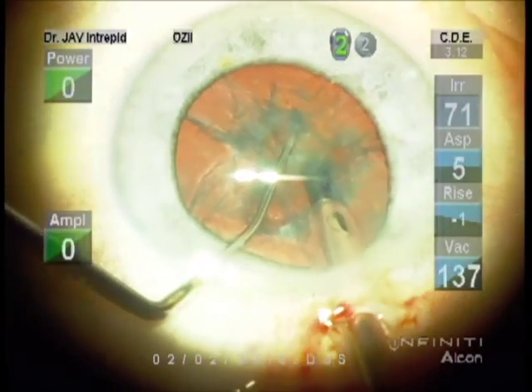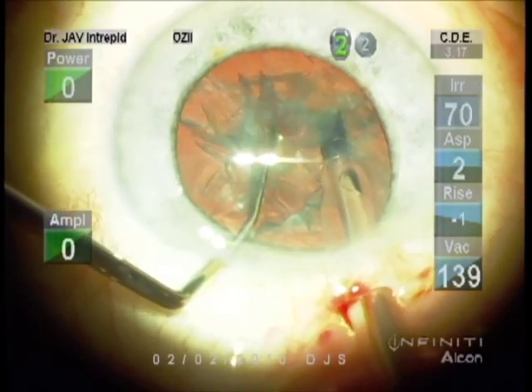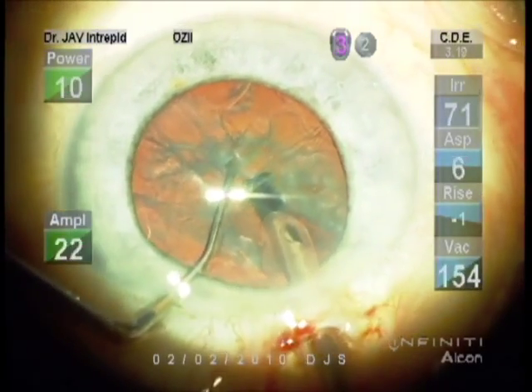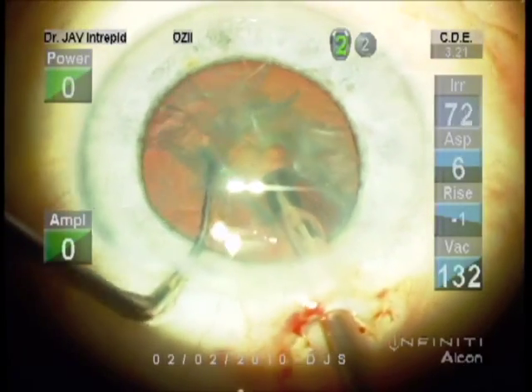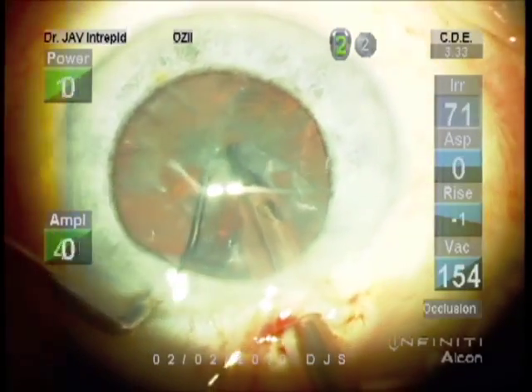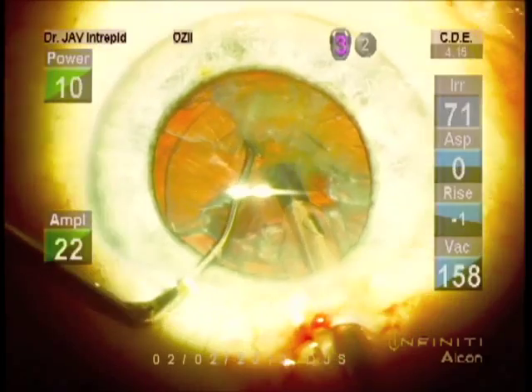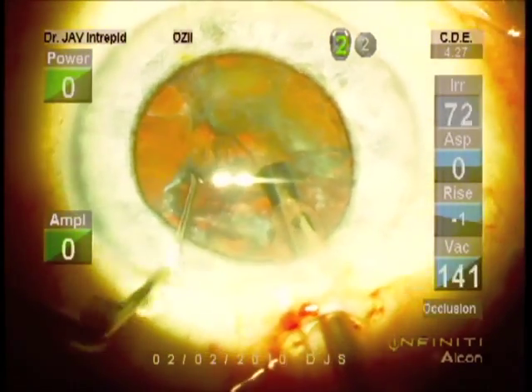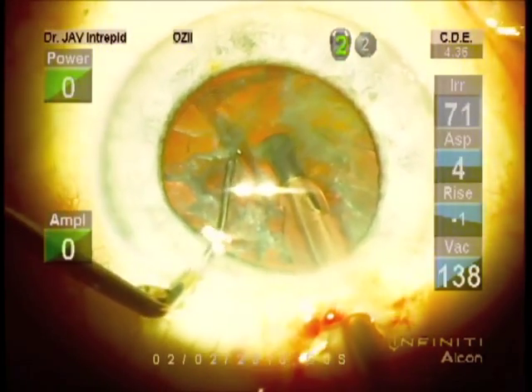First break. Sometimes backing up to do a second break is convenient, then rotating forward. Breaking this quadrant into eighths. The second side usually a little less substantial. Proudness indicates some blockage. And this side into four sections as well — quadrant.